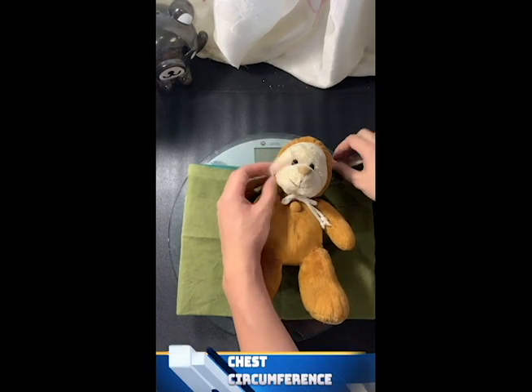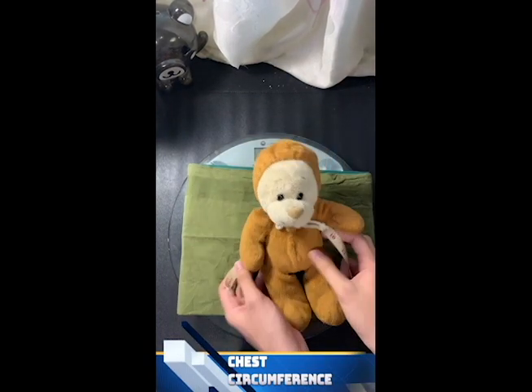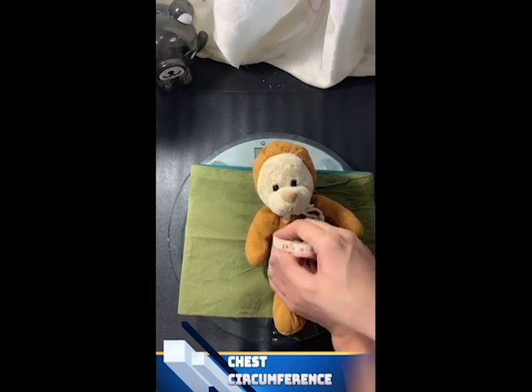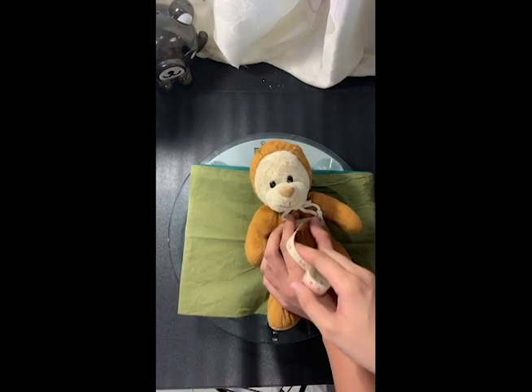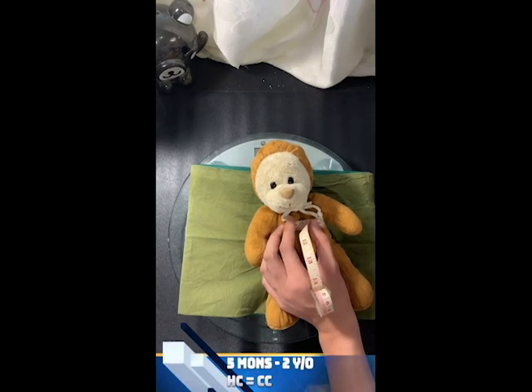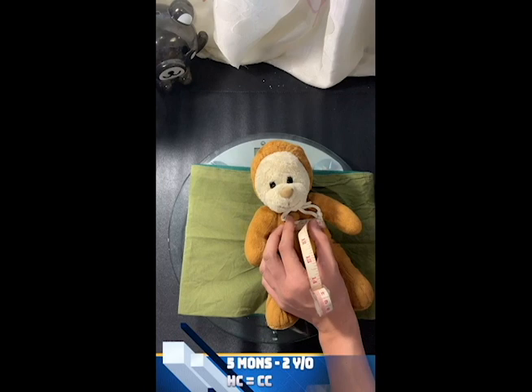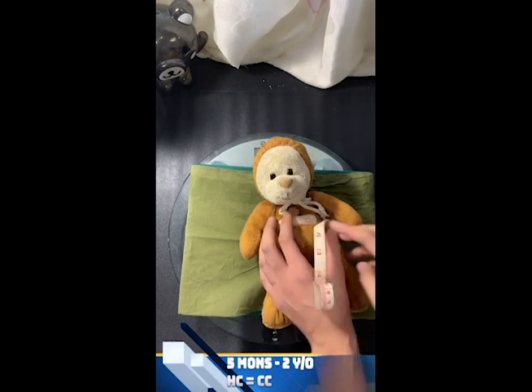Then we move on to the chest circumference. By following the nipple line, we now measure the chest circumference. The chest circumference should be equal to the head circumference for ages 5 months to 2 years of age.